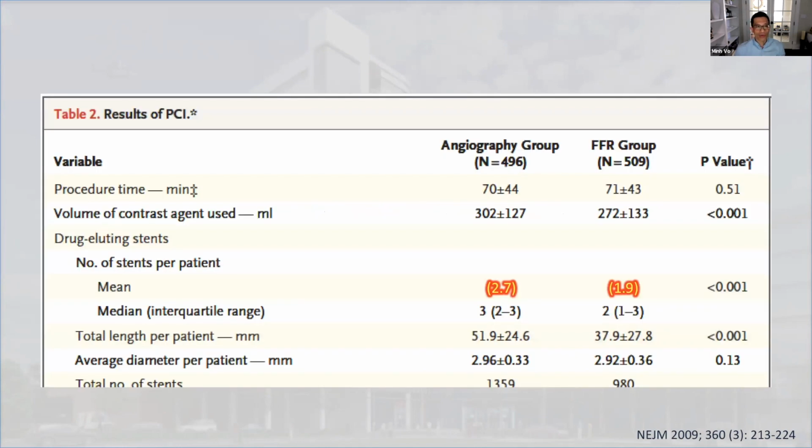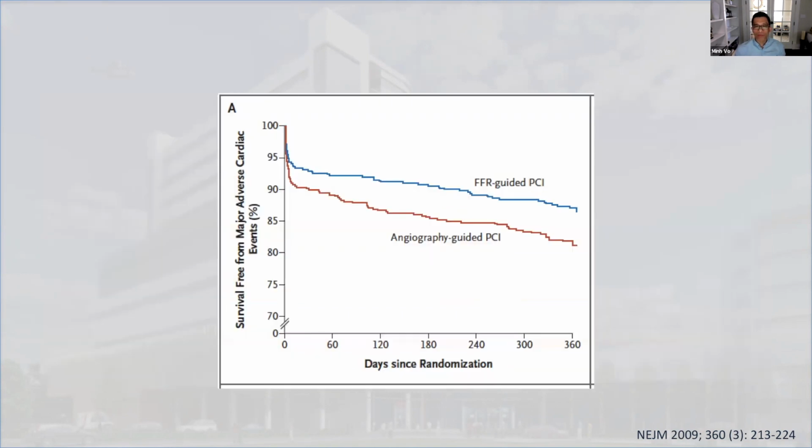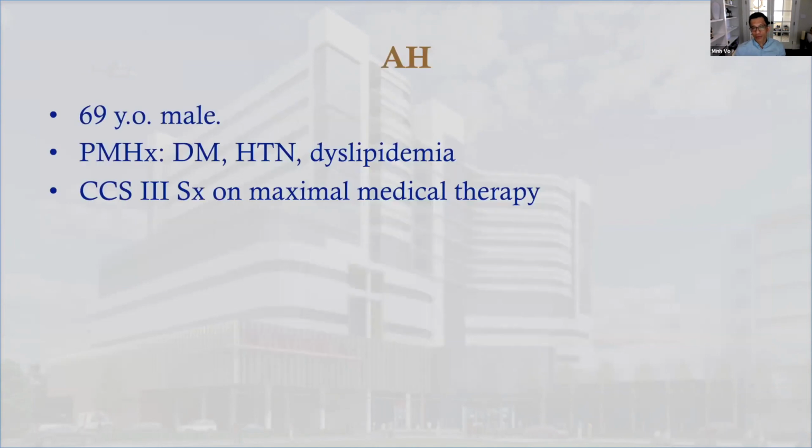And if you look at the actual number of stents, you put in fewer stents for these complex, multivessel patients if you use coronary physiology as opposed to more stents. And again, because these patients are pro-thrombogenic, you really want to keep the number of stents to a minimum. Finally, I'm very comfortable, since I see this data, that coronary physiology guidance versus angiographic guidance actually has a MACE benefit. So patients have better outcomes with coronary physiology guided PCI. So that's the background of how the pandemic has affected complex PCI and how I'm able to mitigate those challenges with coronary physiology as well as other things.